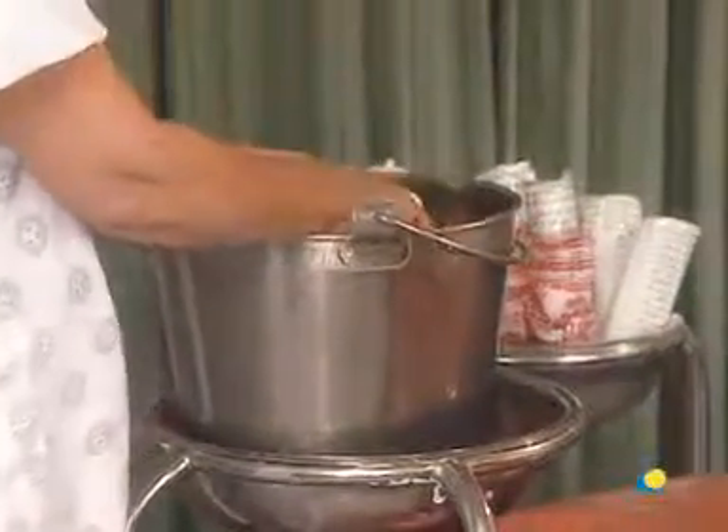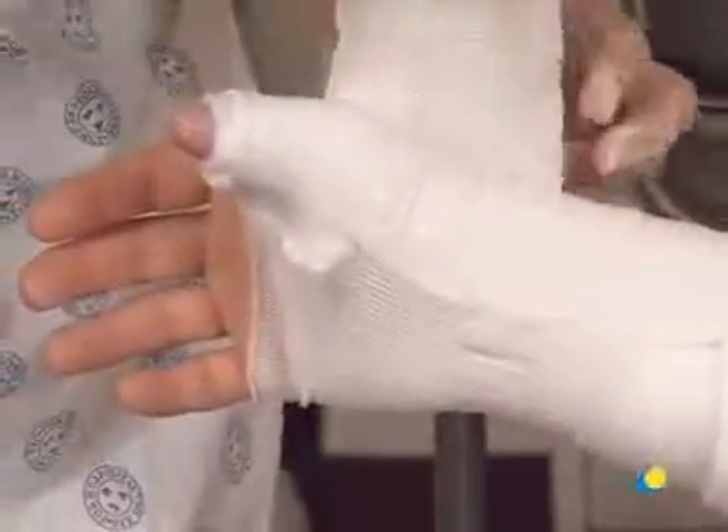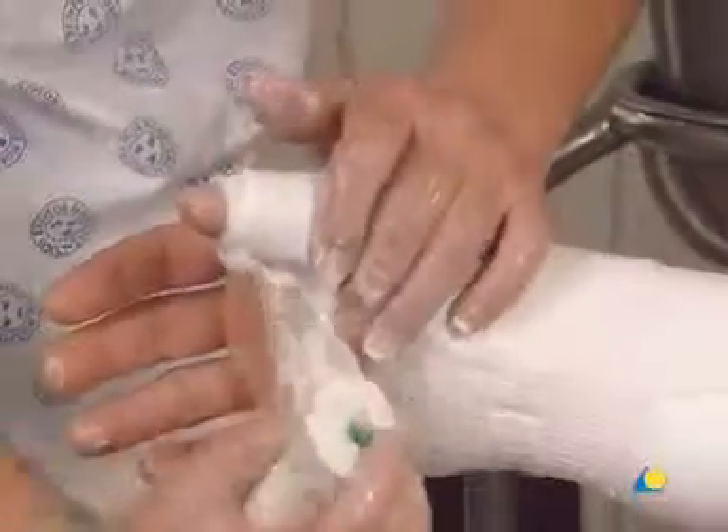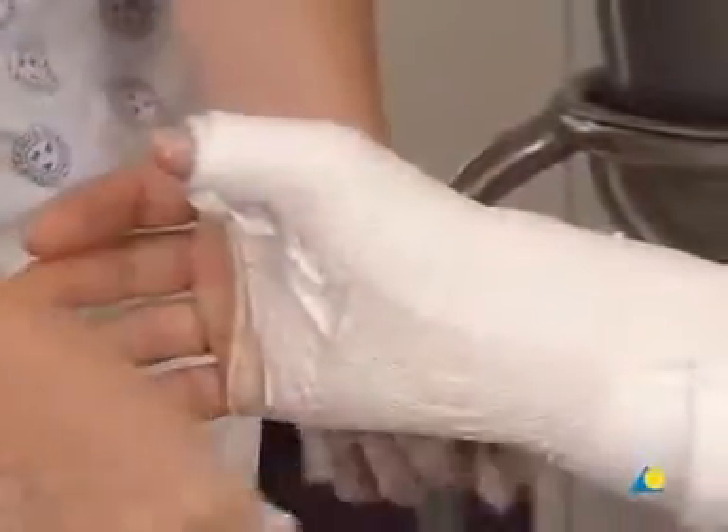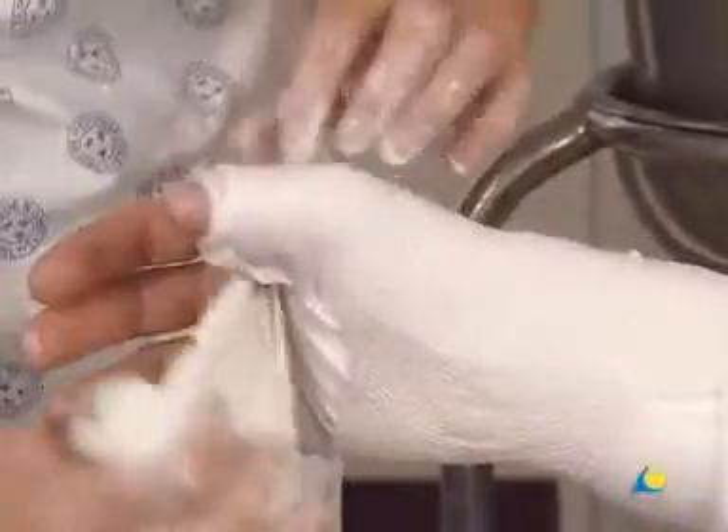The application of the bandage begins at the wrist. The bandage is then passed through the web space, where it is gathered together. It goes over the palm of the hand to the base of the thumb and around the wrist. This procedure is repeated.